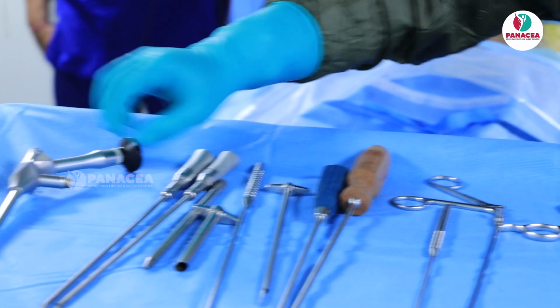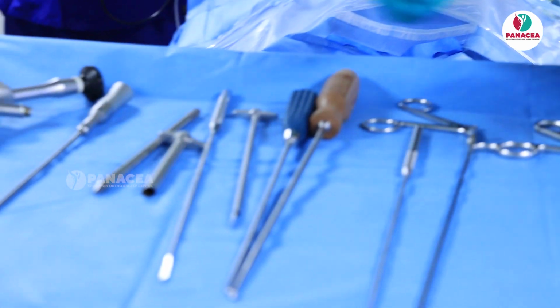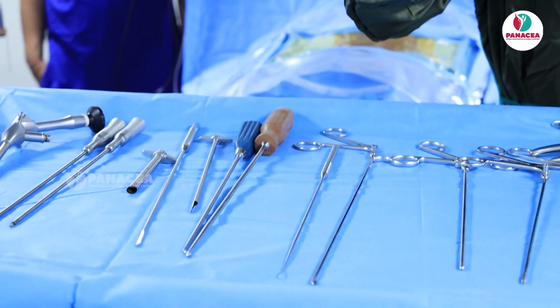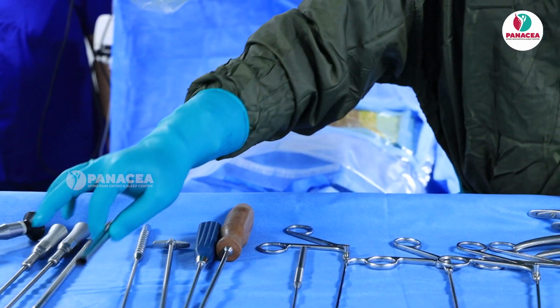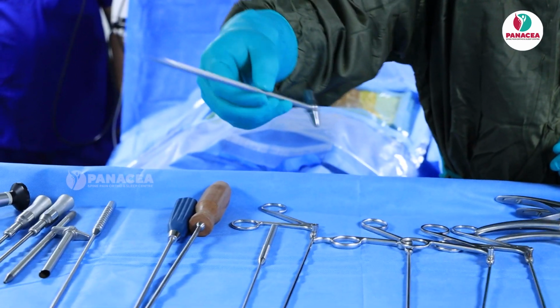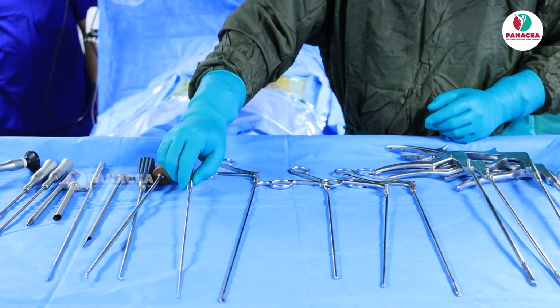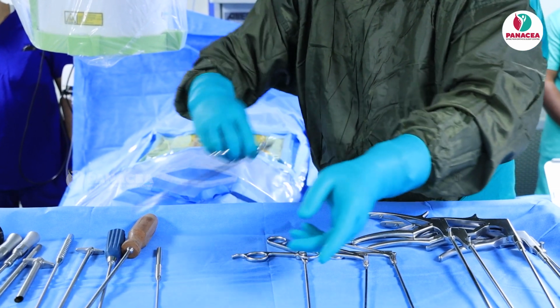If you see the other ornamentarium, these are the burrs. You can zoom here. This is a cutting burr and this is a diamond burr. Usually we use these above L5-S1 wherein you are required to do some hemilaminotomy. This is a dilator, otherwise we call it an obturator. This is a working sleeve, and this is a dissector, a nerve root retractor. Here are the scoops. We have an angled scoop, these two scoops. This is a nerve hook, and you have an upbent annular cutter. Otherwise you can call it a punch.